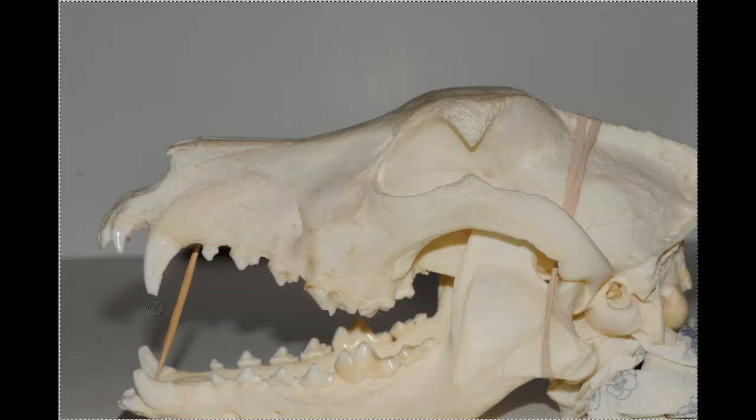Now I have a toothpick holding this mouth open so we can look at one of the largest, if not the largest, tooth in the mouth, which is the upper maxillary canines. Here would be the apex of the canine. Here would be the crown. The theoretical angle of this tooth is a straight line between the apex and crown, which would be that. However, this part of the tooth is closer to vertical and this part is closer to horizontal. And for me, this is the main region of interest up here near the apex that we want to capture.